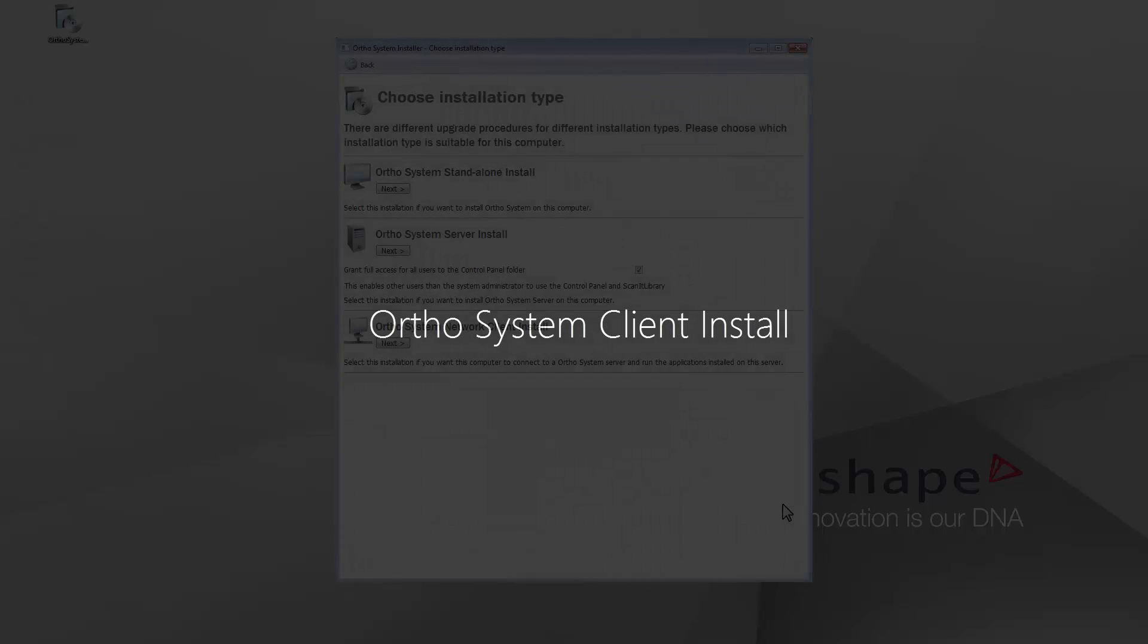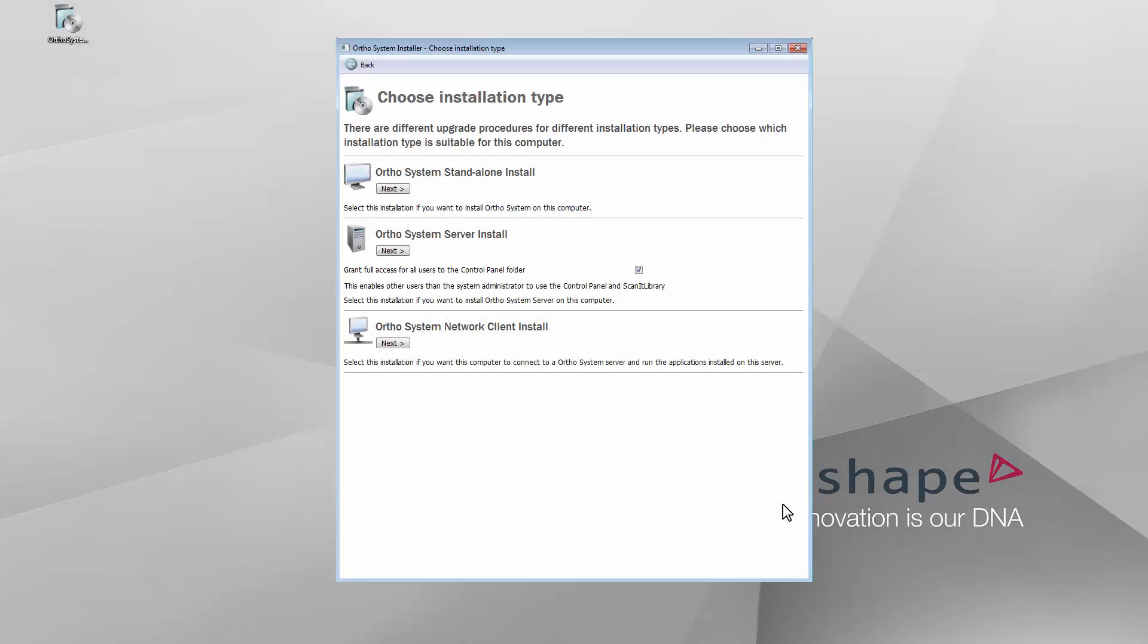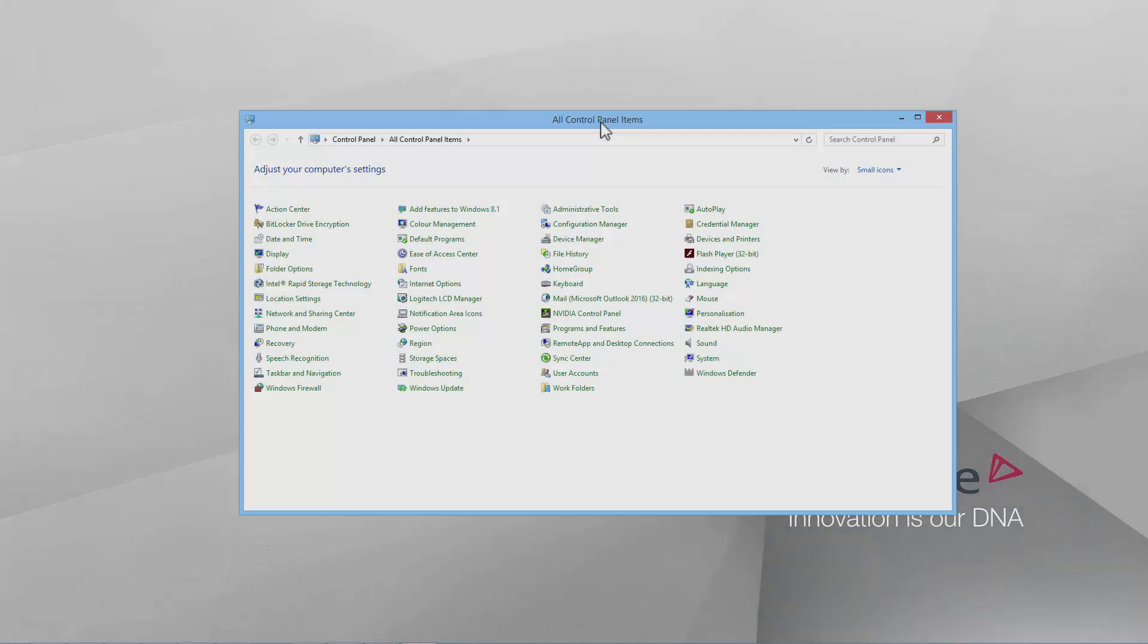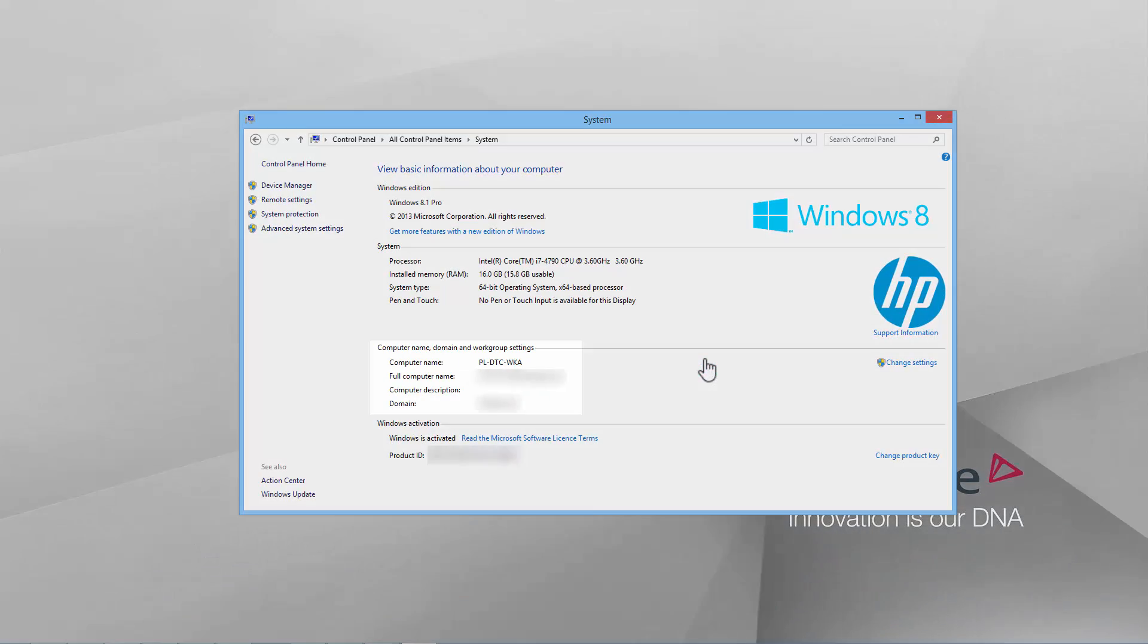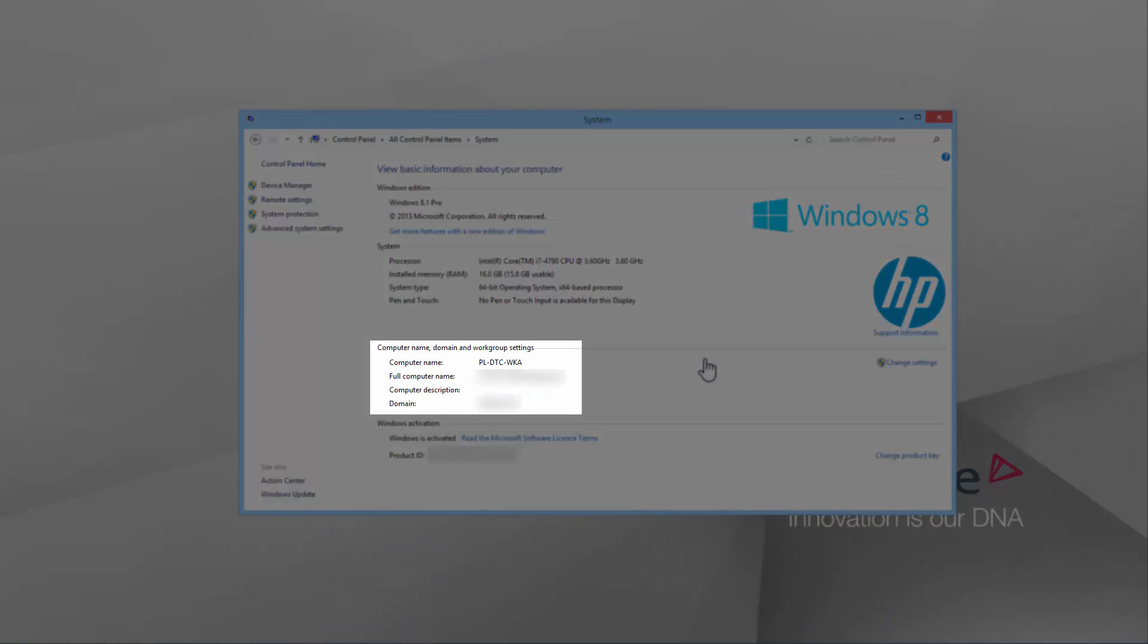Client installation allows you to connect a computer to a server and run applications installed on this server. Standard Windows operating systems will only allow up to 20 connections to any given PC. Before you install the OrthoSystem on a client PC, you need to know the name of the server PC. Enter the control panel on the server PC, select System and there you will find the computer name. Remember this name for later.